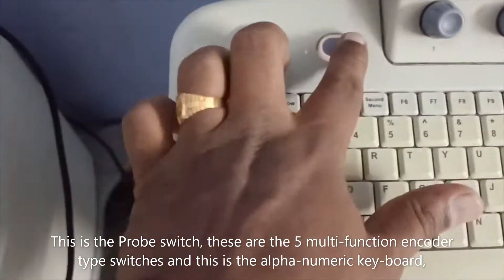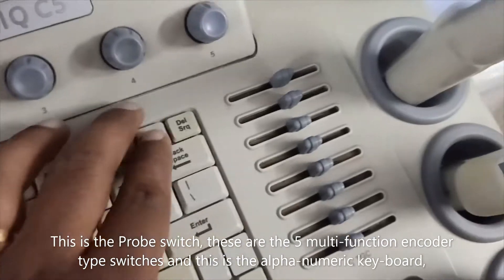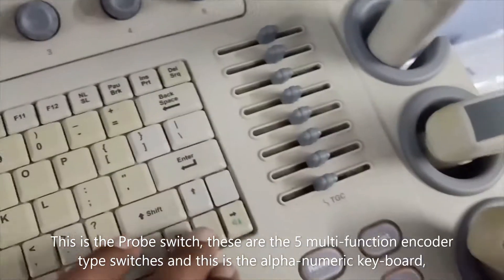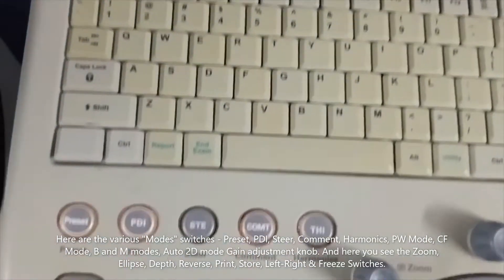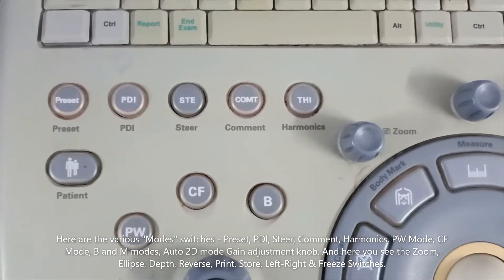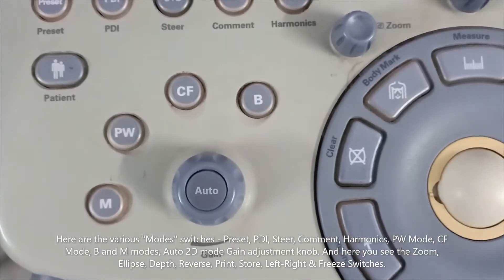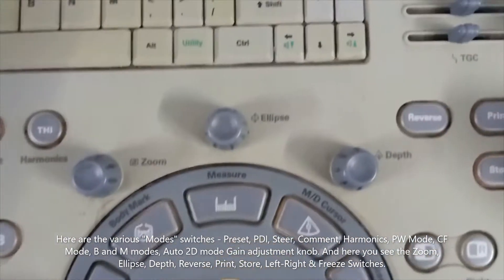This is the probe switch, and these are the five multi-function or encoder-type switches. This is the alphanumeric keyboard. Here you can see the mode switches: presets, PDI, steer, comment, harmonic, patient, PW mode, CF mode, B mode, M mode, auto 2D mode, and the gain adjustment knob.